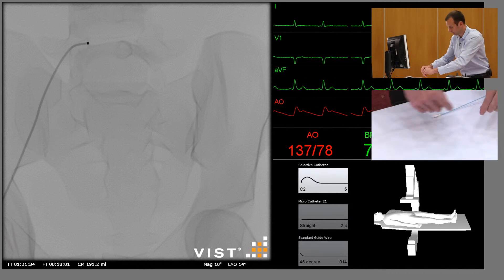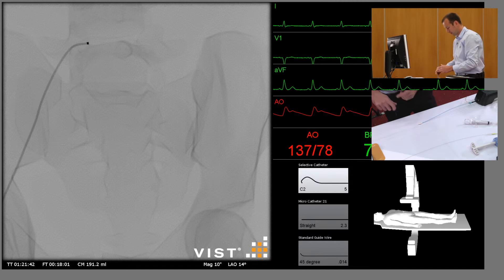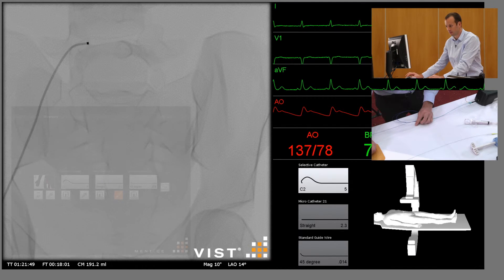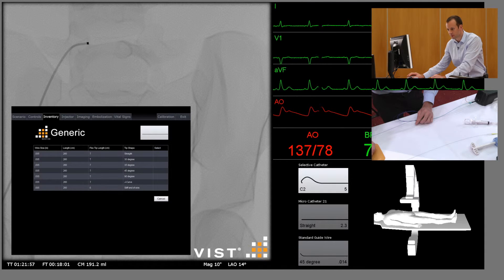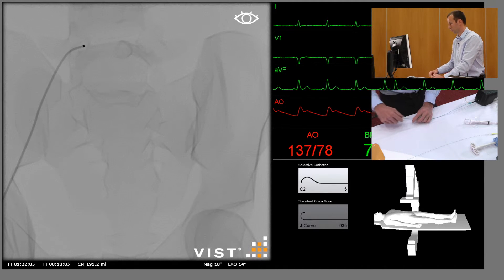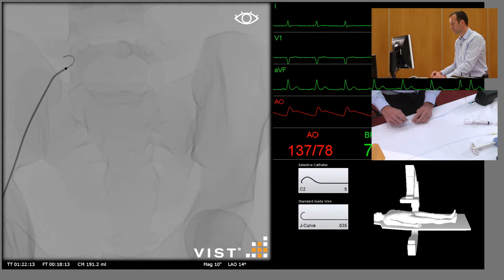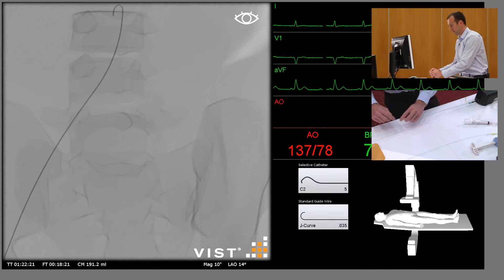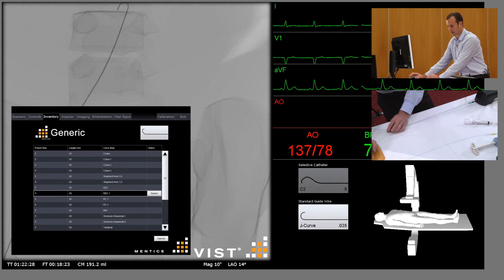To do this, we're going to have to change the catheter to something that will allow us to select the right internal iliac artery. So standard practice: remove the micro catheter, select an appropriate guide wire and use the standard J-tip guide wire. Advance that into the aorta, remove this catheter and change it for something that will allow us to select the internal iliac artery — in this case a renal double curve catheter.